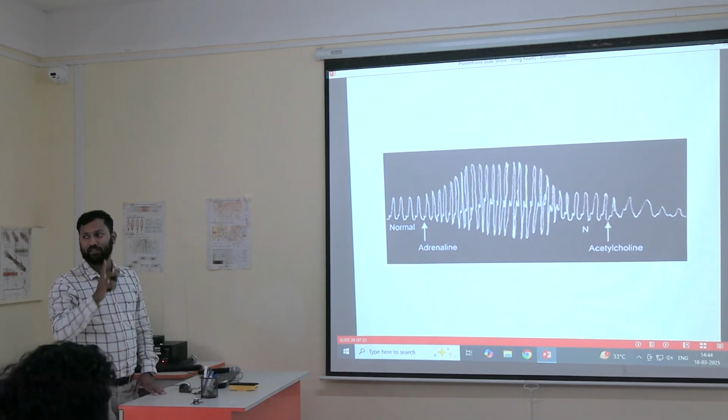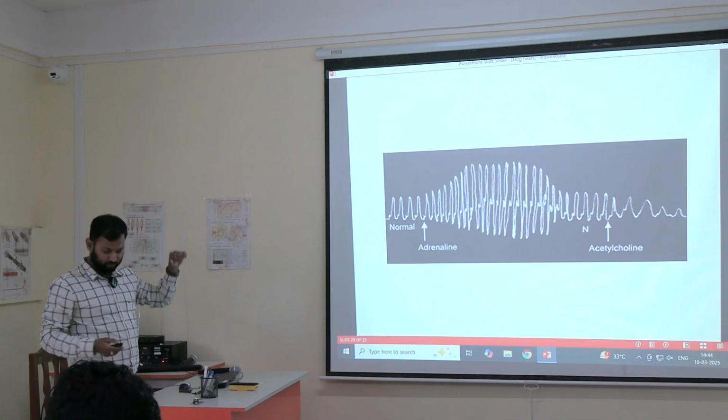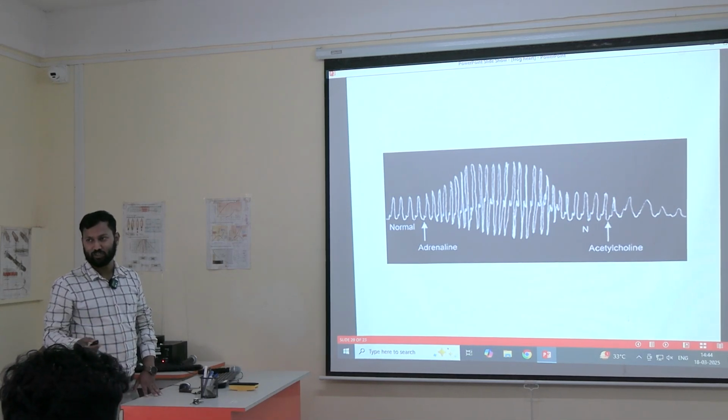You have heard the name, na? Adrenaline, the name of the drug or name of the hormone which is present in our body. That adrenaline we are infusing in the frog's heart. We are infusing it in the Ringer's solution.